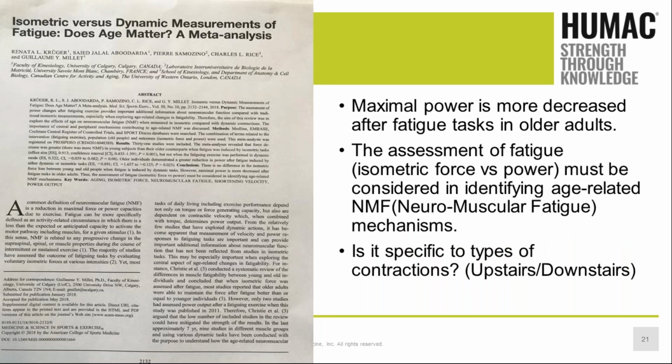So all of those things kind of come back to what are we doing and how are we progressing the patient correctly. We also know as we age, and how many older geriatric patients might we have in our practice that could benefit from some type of stabilization and or strengthening program. It's not all about how hard and fast you can push, but really teaching them how to control their muscle strength and their force production.